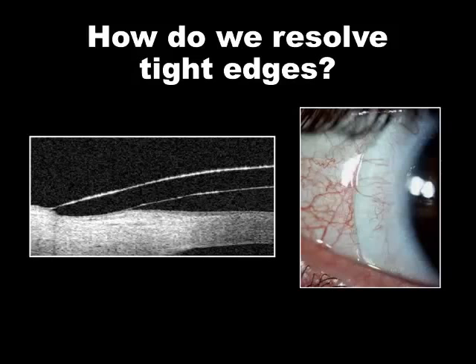Now the last zone in the lens is the scleral landing zone, and this is where we'll often see in scleral lenses blanching of the vessels. We've backed up the vessel supply right at the tip of the edge, and this is usually caused when the lens angle is coming at far too steep a rate for the actual surface. So more often than not, we see the blanching when the patient's scleral angle is really flat, flatter than the normal design of the trial lens. So this is a simple problem to fix. By increasing the angle of this zone, we can create a better match of lens to cornea relationship.